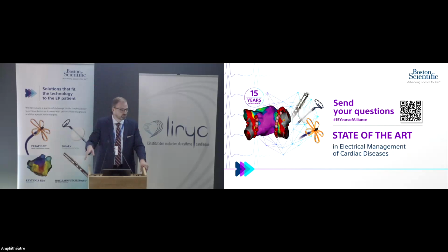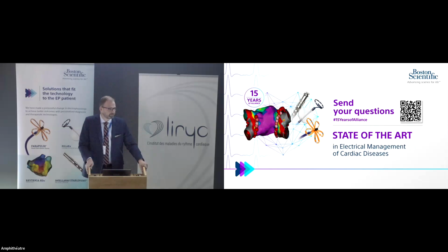It's a super useful tool if you've got CT and you can see a large atrium and a large common ostium or something like that. You just maybe want to be diligent with your positioning to make sure that the splines aren't gathering and you're not missing a spot. Otherwise, there's no reason to believe they'd be different. Thank you. That's very important.